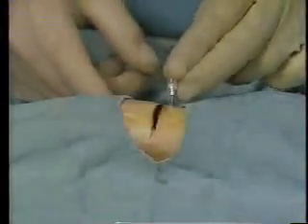Wait 3 to 10 minutes, then test for numbness with a sterile needle. When it is certain that the area is anesthetized, the actual suturing procedure can begin.